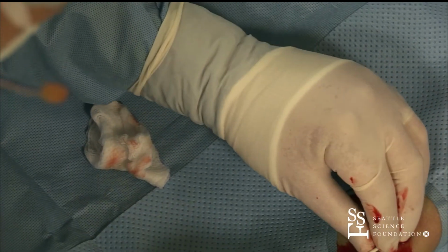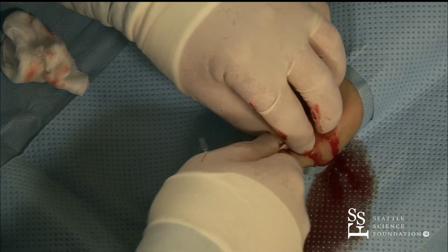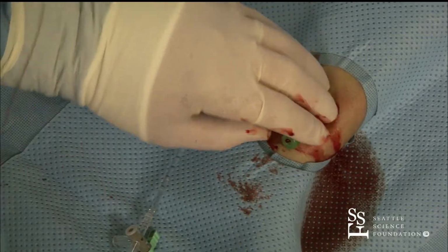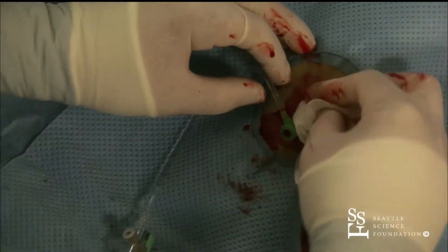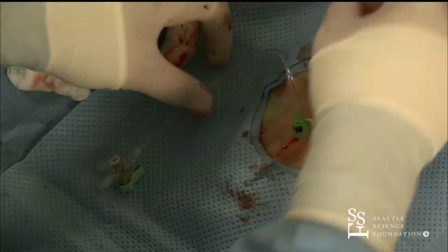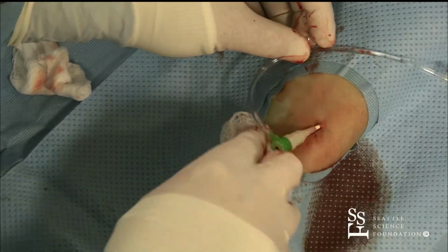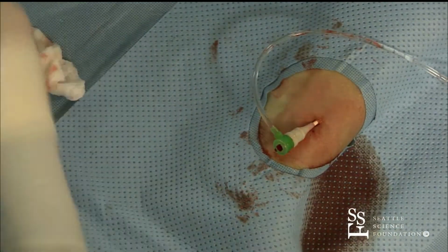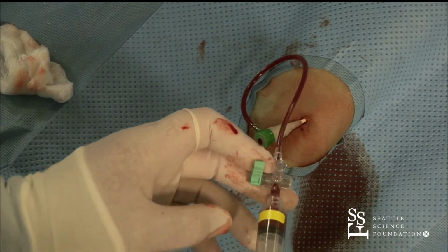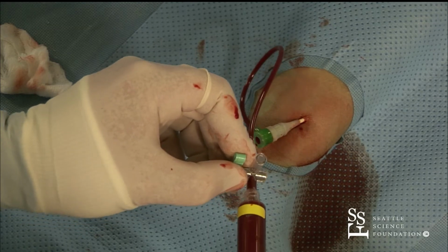Okay, so this is what we call a Slender sheath here. A little pressure there, and that should do it. Can you guys give him a little bit of sedation, please? Okay, thank you. If they're having pain at the access site, even after we've got access with the wire, I'll typically put another cc of lidocaine underneath the artery, because we tend to numb them up superficially. And if they're having pain when you're pushing the sheath in, do that, and then they won't feel anything.